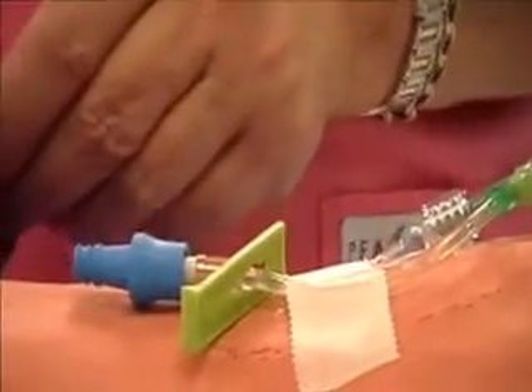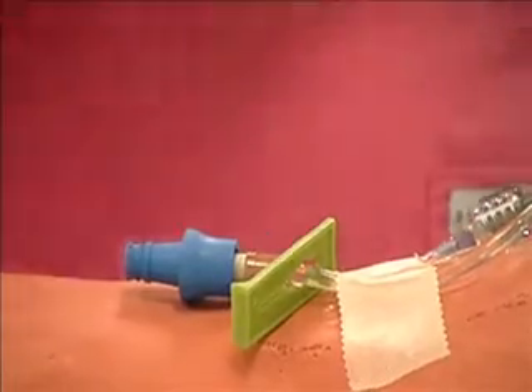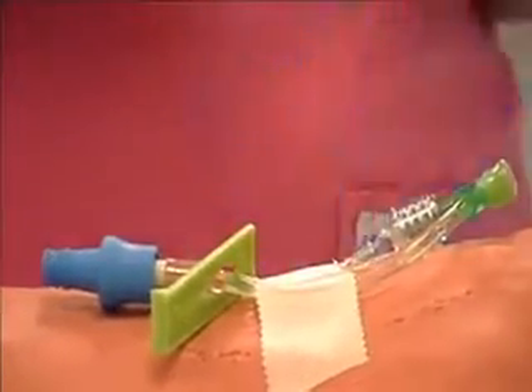Perform hand hygiene and apply gloves. Assess IV site.